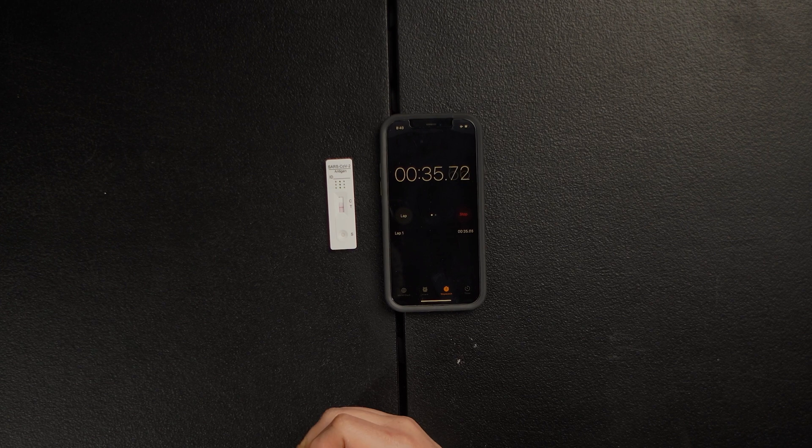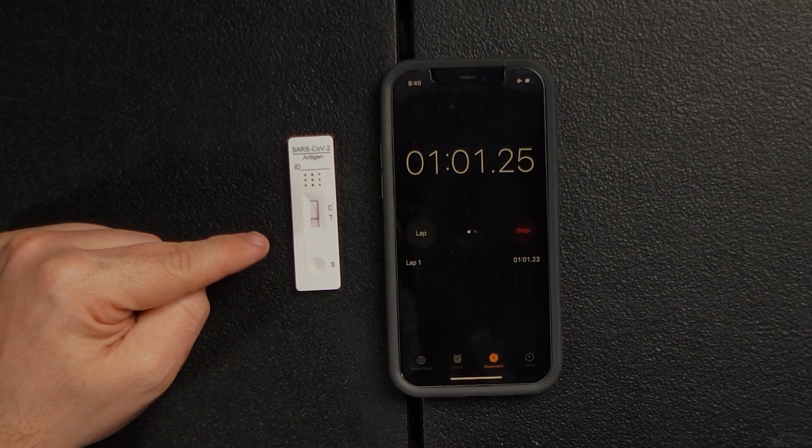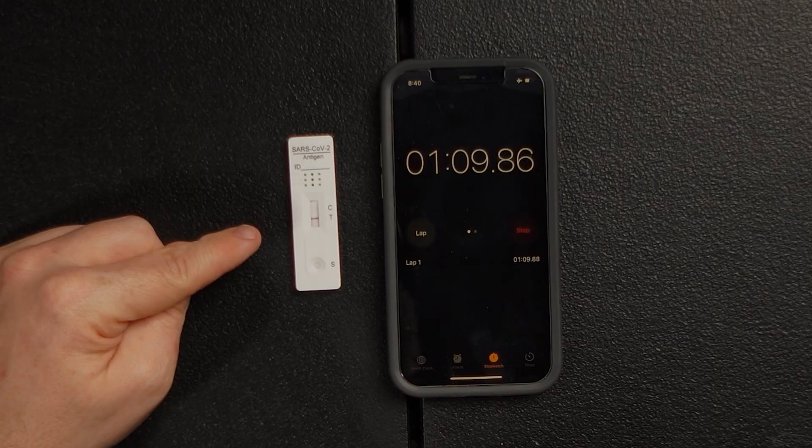But you need to wait for the control line — if C does not have a line, then this is a faulty test. You need the control to work and also have a magenta line. We're at 40 seconds, about to pass C. We're at 50 seconds, waiting for C to show a line. The test line is solid. There we go — control shows a line. We're at one minute. This 15-minute test took one minute for me to get results. I am 48 hours into COVID and tested positive yesterday and this morning.